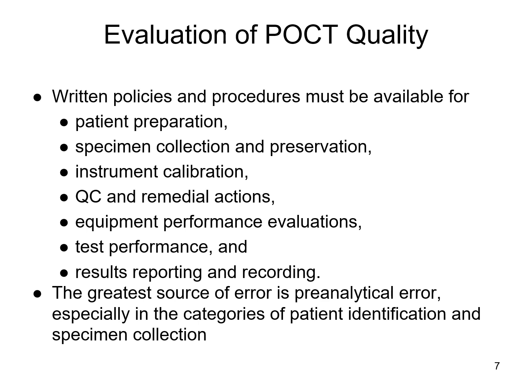And in most cases, you're not going to run testing, you're going to probably send it out. Or it could go through a checklist of things like repeat the QC, try this, recalibrate the analyzer. So it could just have a process of what you should do if QC fails. Any kind of equipment performance evaluations, any kind of maintenance checks, temperature checks, things like that.